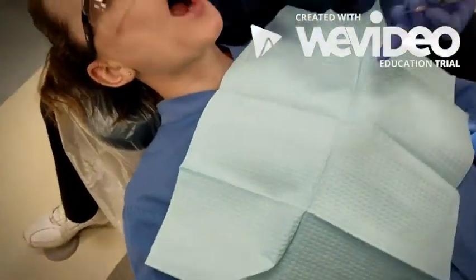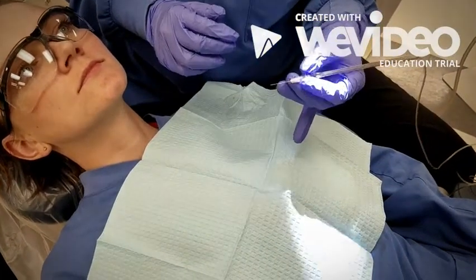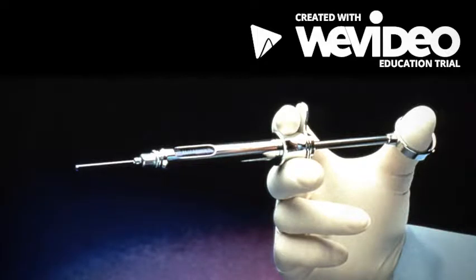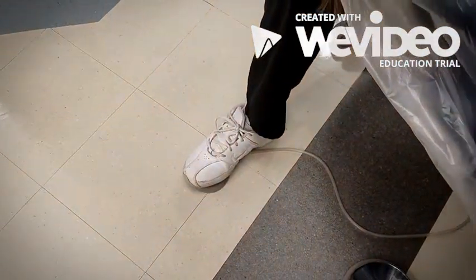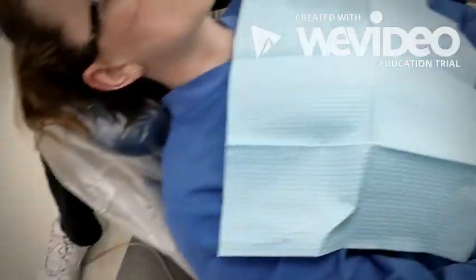The next thing that is different is aspiration. Again, with the traditional syringe, aspiration is operator dependent because your thumb is used to create back pressure for aspiration to occur. However, the wand automatically aspirates on demand by simply releasing the foot control. And to test this, I'll press on the foot control for a few beeps, then release.